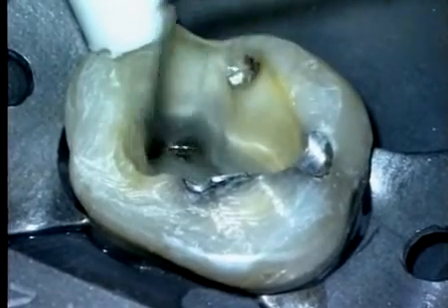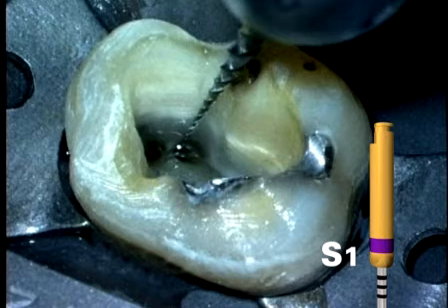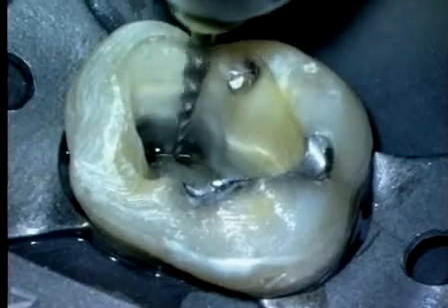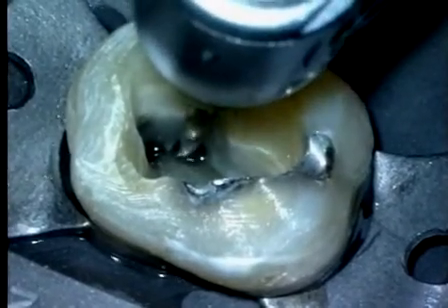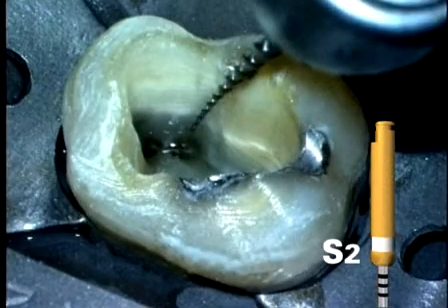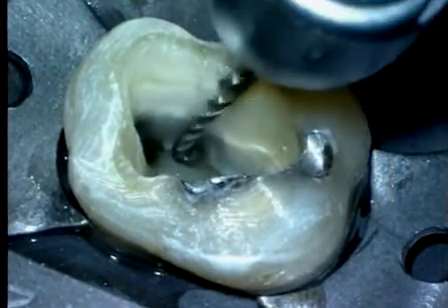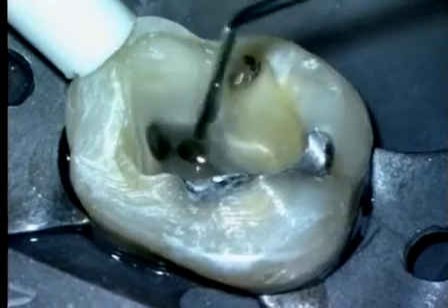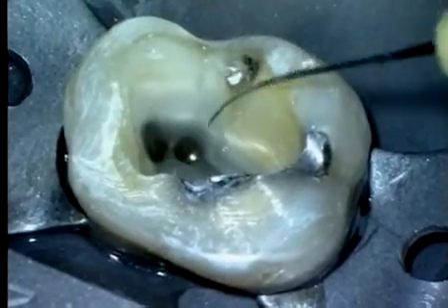With a smooth reproducible glide path, we can now use Shaper 1 to length. Shaper 1 is carried into the canal and will work primarily at the junction of the middle and the apical 1/3. Shaper 2 now can be carried to working length, and it's again allowed to move into the canal, and the shape can usually be cut in one single pass. Following the use of Shaper 1 and Shaper 2 to length, it's time to irrigate and recapitulate and re-irrigate.